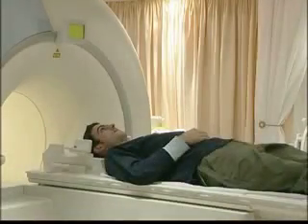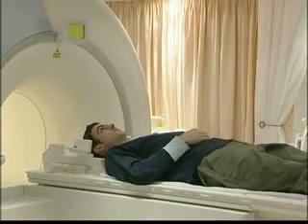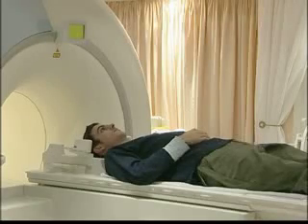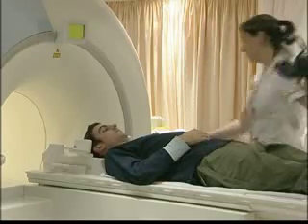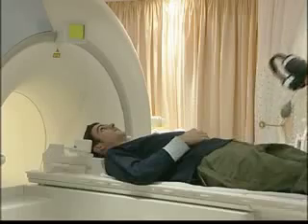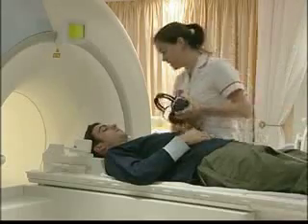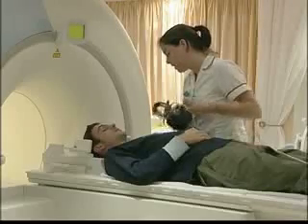Thankfully for this patient, a CT scan has already shown that the top of the spine hasn't been fractured, but damage to the brain has yet to be ruled out. Magnetic resonance imaging, or MRI, with its excellent soft tissue discrimination, is the best way to check for this.